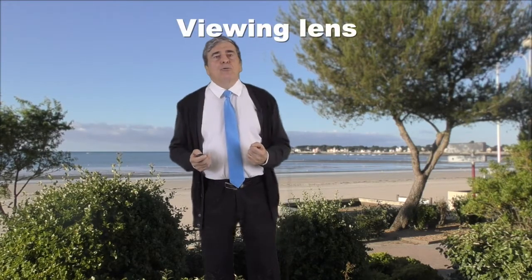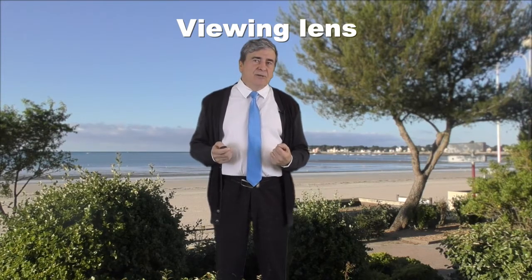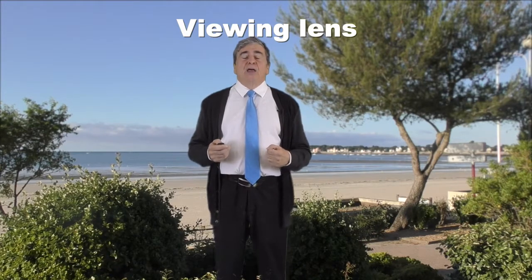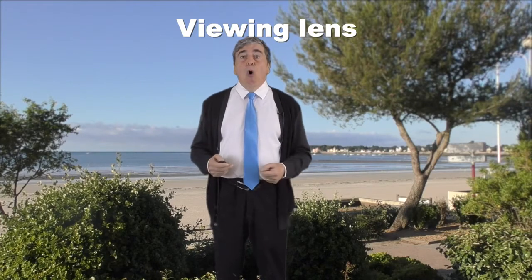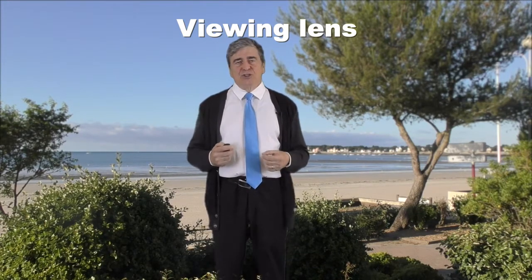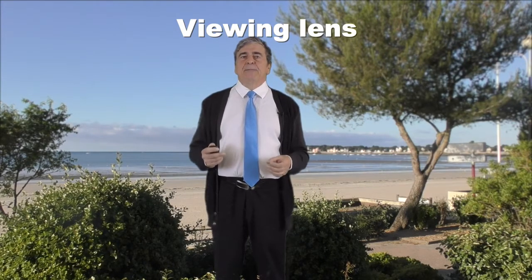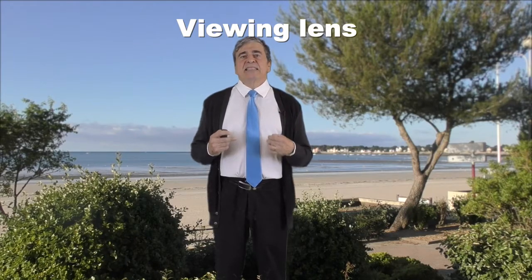Let's go now to the viewing lens. The choice offered to the operator is to privilege either 360-degree view or the quality of the image — you cannot have both. When we talk about macular surgery, the choice is quickly made: it is the quality of the image that must be preferred, and this leads us to exclude large-angle lenses. No photographer wanting to make a close, sharp portrait will take a wide-field lens.